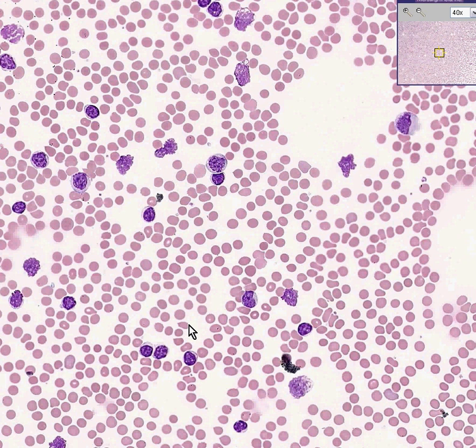This is chronic lymphocytic leukemia. You can make very confidently the diagnosis of chronic lymphocytic leukemia if you know the patient's total lymphocyte count and their age. And one rule of thumb, even though this has changed by some of the purists who seem to be very prominent in the field of hematology, is that if you have a person that's in their 50s or 60s and they have a sustained lymphocyte count of 20,000 or more, you can diagnose chronic lymphocytic leukemia.